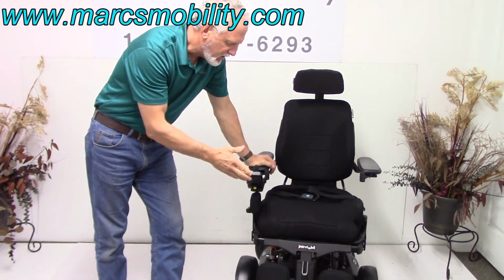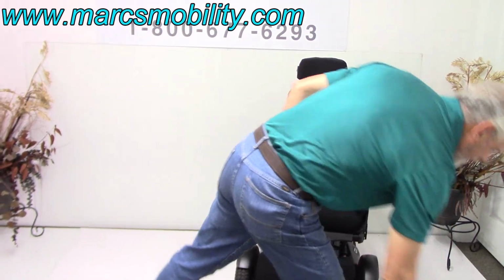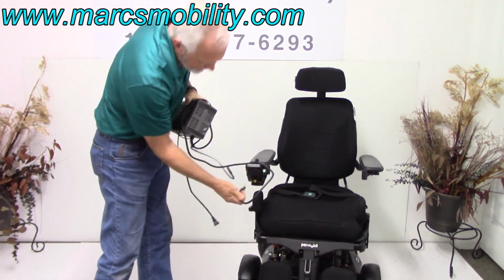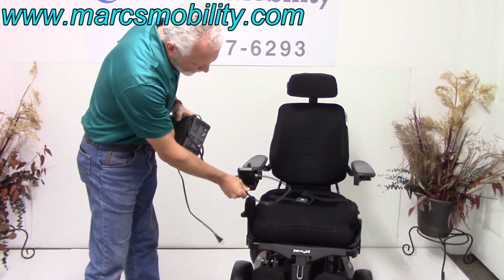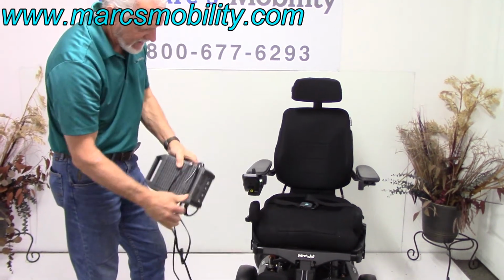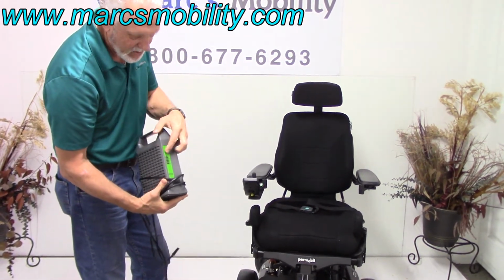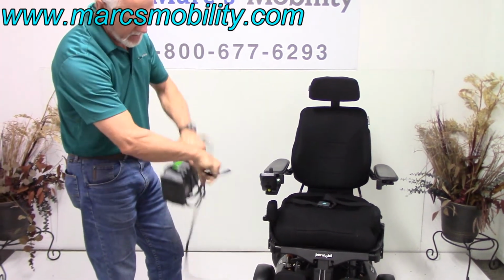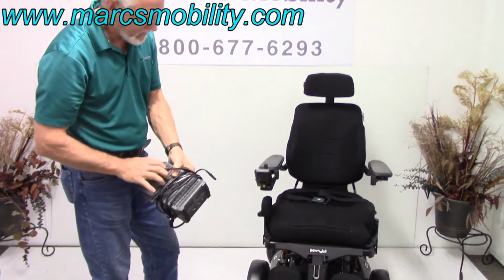When you charge this chair, you take your Permobil charger, like most power chairs out there, plug it in the bottom of your joystick right here, and plug it into the wall. It'll tell you when it's 100% full. When it reaches 100% full in this charger, the charger will stop charging. So you don't have to worry about overcharging your chair.